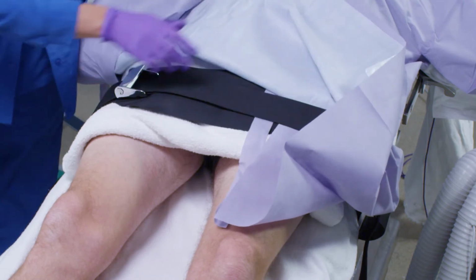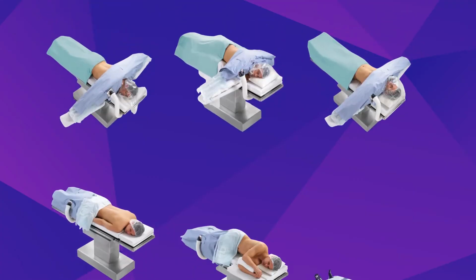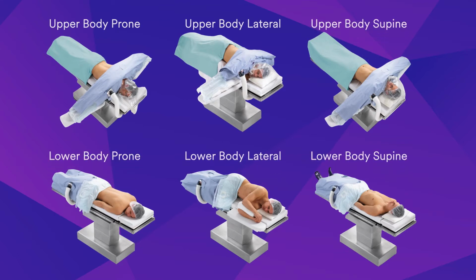The patient's position will dictate the position of the warming gown. There are plenty of options. The gowns can be used for upper body prone, upper body lateral, upper body supine, lower body prone, lower body lateral, and lower body supine.